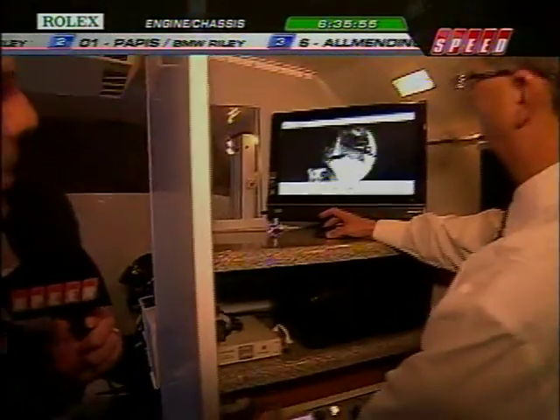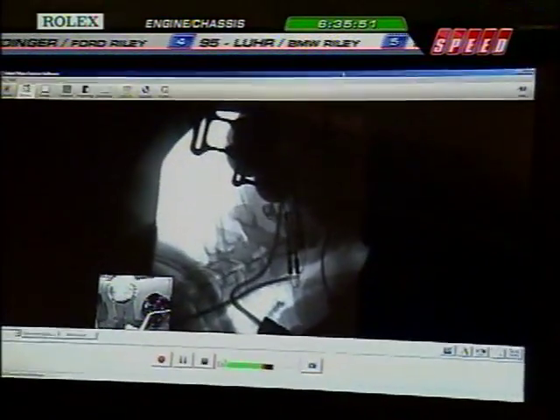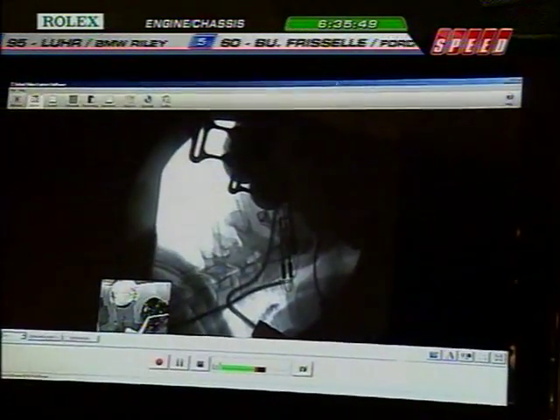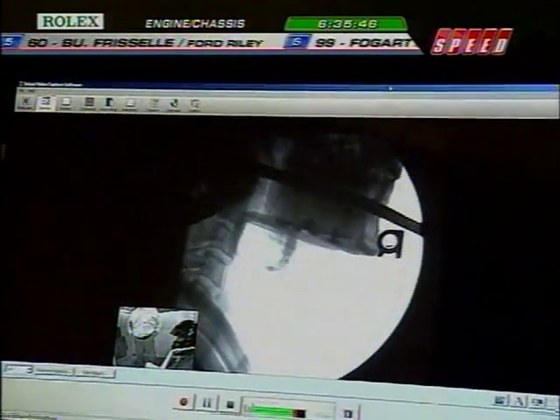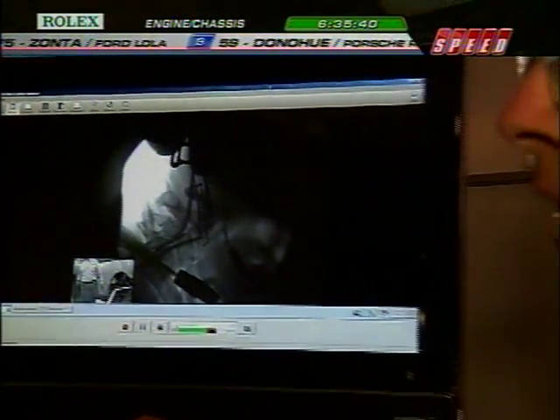And now back over here, we can actually see Darren's x-ray up on the screen. Once again, when he throws his head forward, you can see his neck right here, and those tethers get taut, and if those tethers are too long, we see his neck go too far forward. So, Dr. Mike Smith, what are you looking for, and what would you typically tell a driver like Darren?